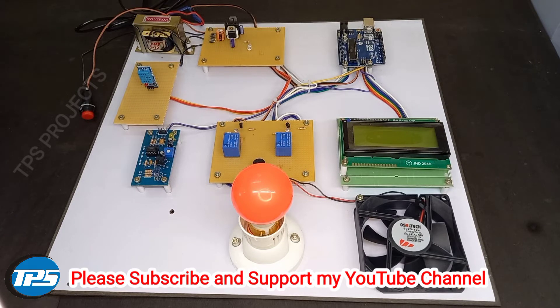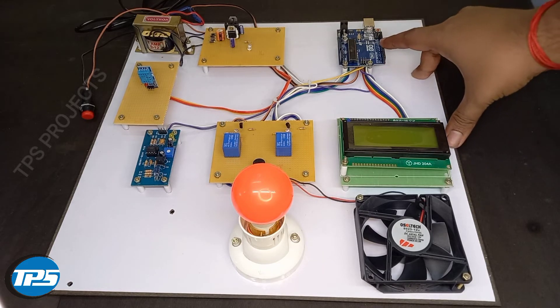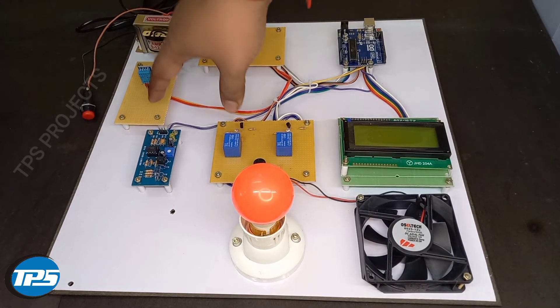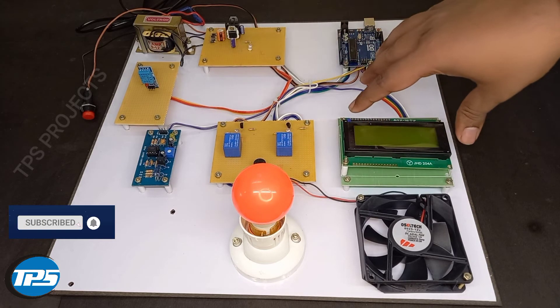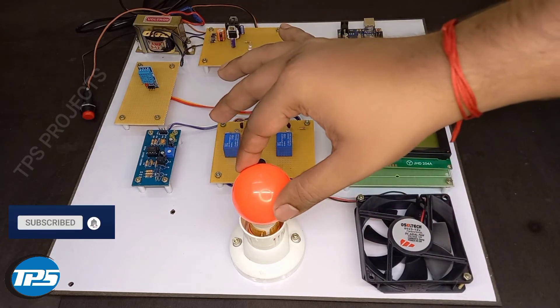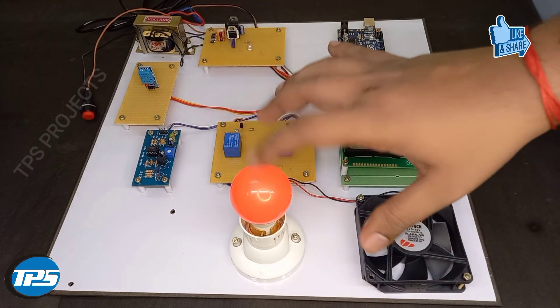Here we introduce an incubator system which consists of a heartbeat sensor integrated with it. The parts required for this system include an Arduino microcontroller, a power supply section, a temperature sensor for detecting temperature, a heart rate sensor for detecting heartbeat, an LCD display for displaying values, a fan to control the temperature, and a bulb for the light source. A relay system is used to control the fan and light system.